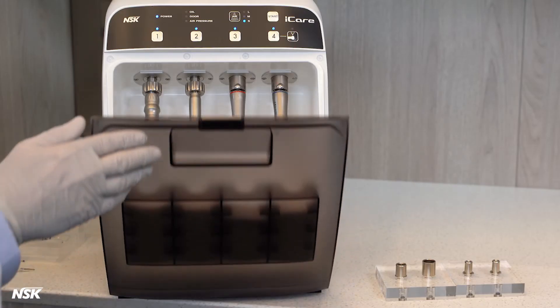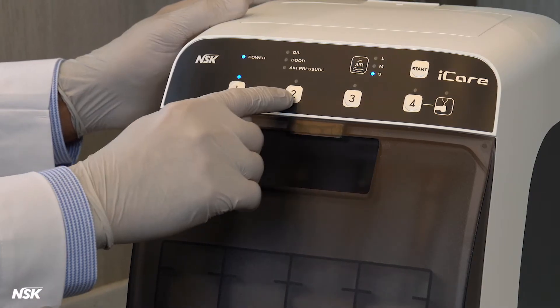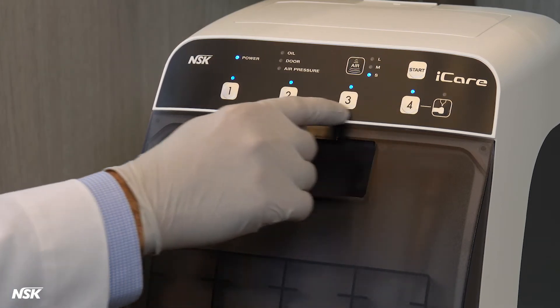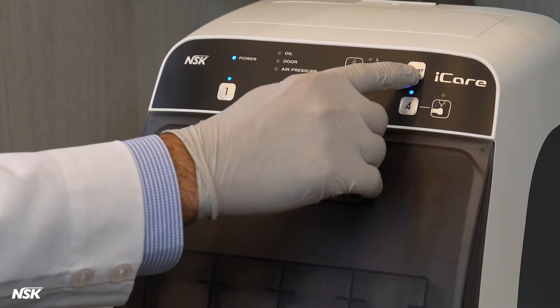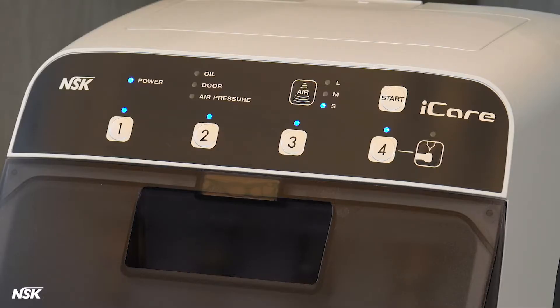To start the lubrication process, close the door and activate only the ports which have a handpiece connected. In this case, we will select all four ports, then press the start button. This will start the lubricating and cleaning process. You will notice the port is working by the blinking light. Eye Care cleans one handpiece at a time. When lubrication of all connected and activated ports is complete, you will hear a long beep and all lights will turn off.